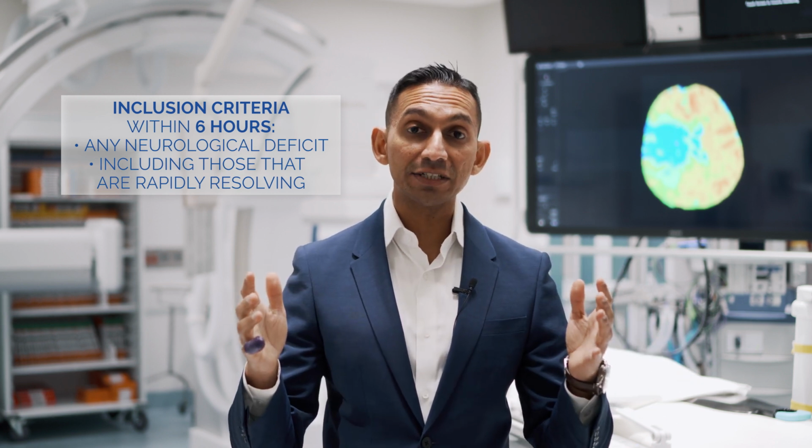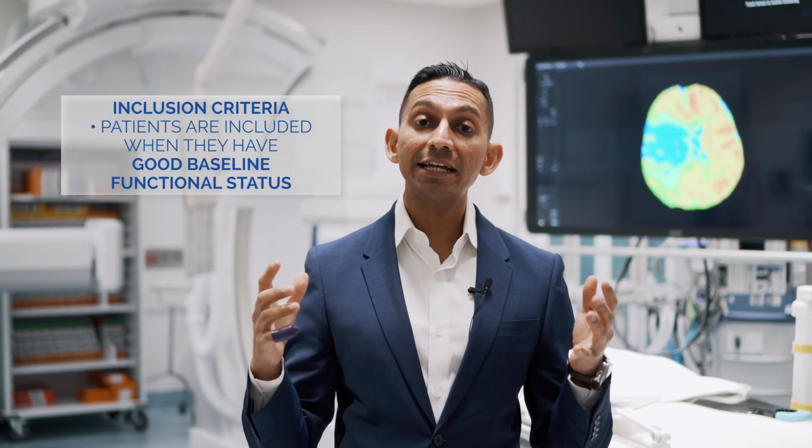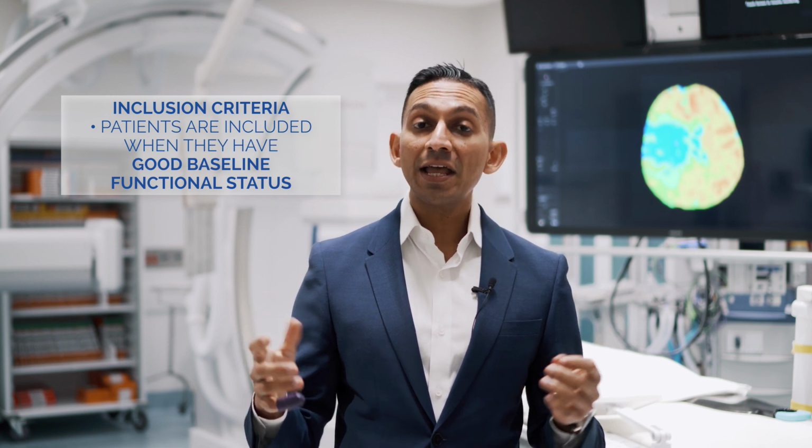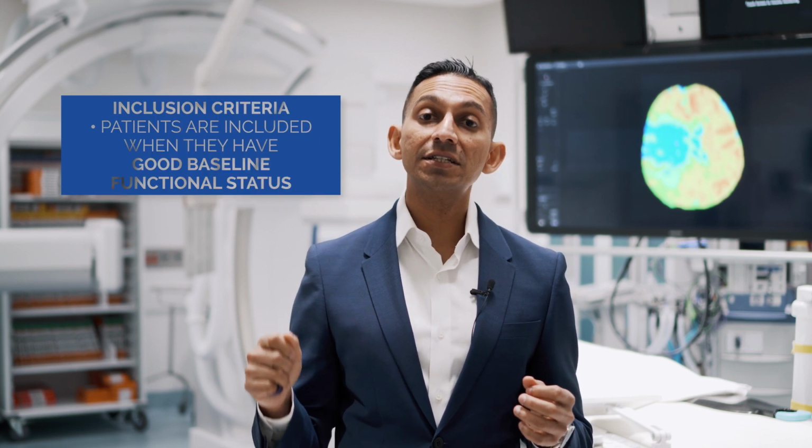The code stroke procedure is activated when the patient fulfills certain clinical and time-based criteria. Within 6 hours from last seen well, the patient is included if they have any neurological deficit, including those that are rapidly resolving. Between 6 and 24 hours, patients are included if they have persistent or fluctuating symptoms. Patients are included when they have good baseline functional status. For example, a patient should be able to walk from one room to another room without the assistance of another person. After code stroke activation, the patient is rapidly assessed by the stroke team.